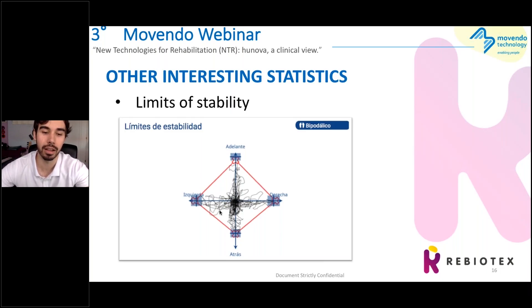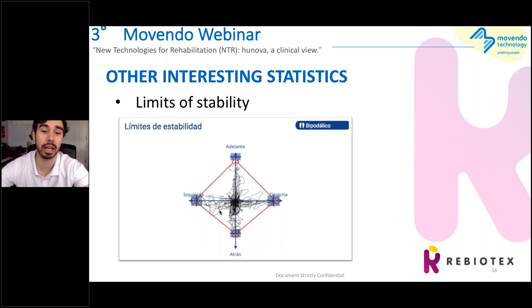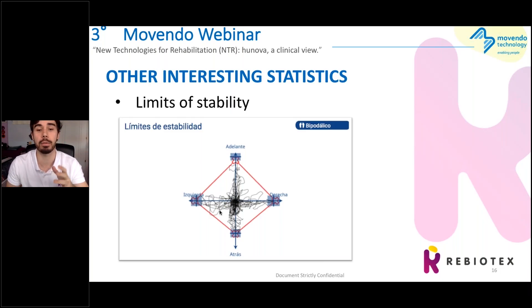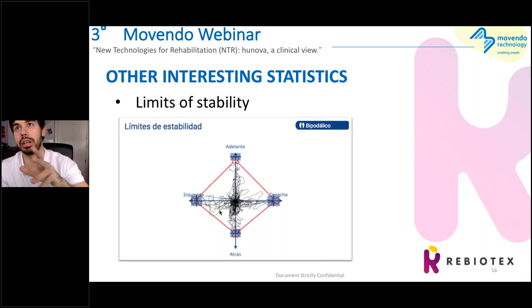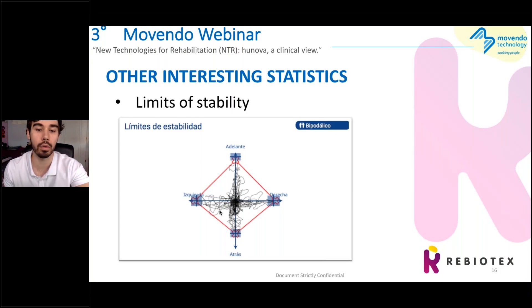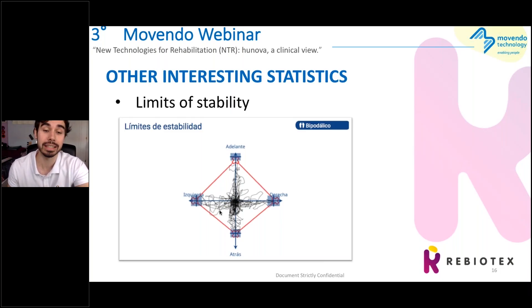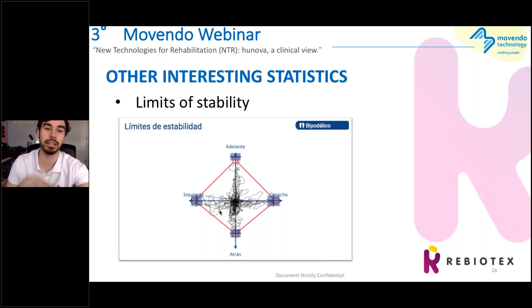This is a really famous graphic — the limits of stability. I think all posturographs have it. You have to reach some goals: forwards, to the right, to the left, and backwards. In this patient it is barely normal — barely okay. If we think about a stroke patient with right-side involvement, the cross wouldn't arrive at the goal and would stay closer to the middle. Again, it's an interesting tool to see how the patient improves when loading weight on the affected side.